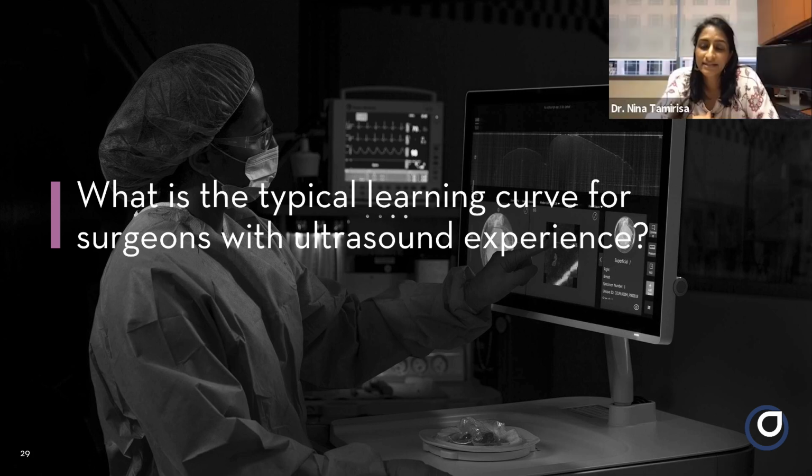Yeah, and I can say the same for that weekend training as well. Certainly, after the first couple of cases, it really did feel like your eye just kind of gets trained to see disease at the margin. So you can quickly scroll through once you get used to it to see where disease is at the margin. Plus, you have so many different things to look at. So you have the photograph of the specimen, plus the on-face view, plus the magnified view. So all those things, I think, really help.